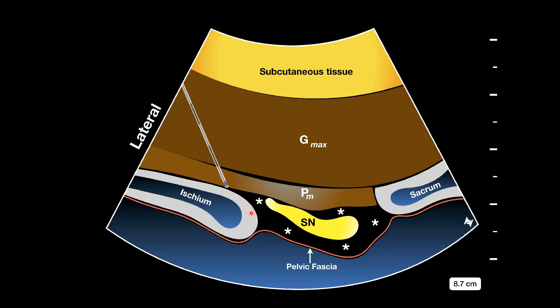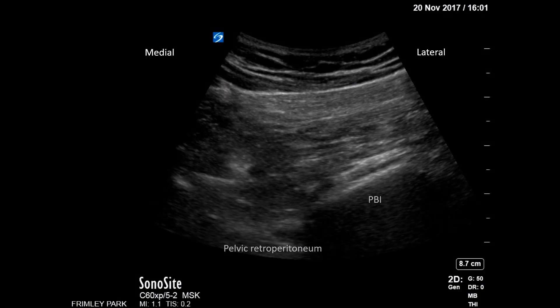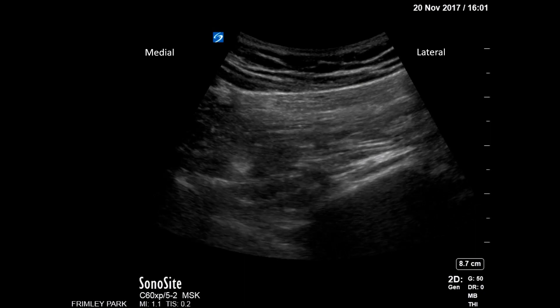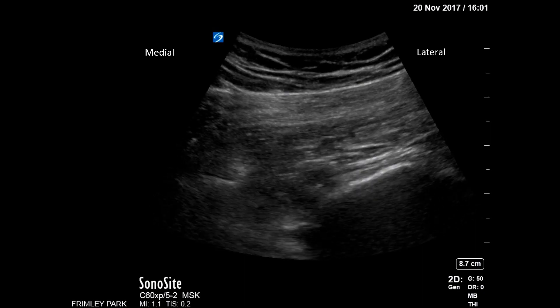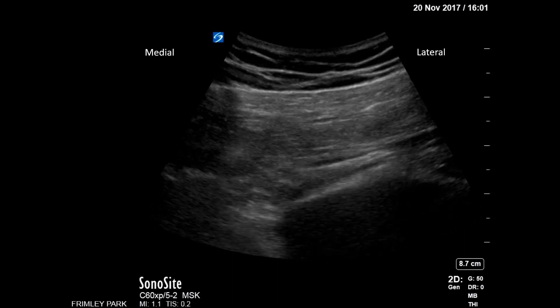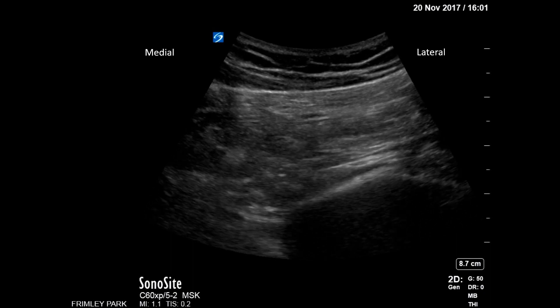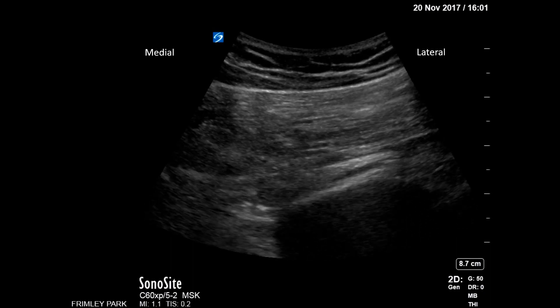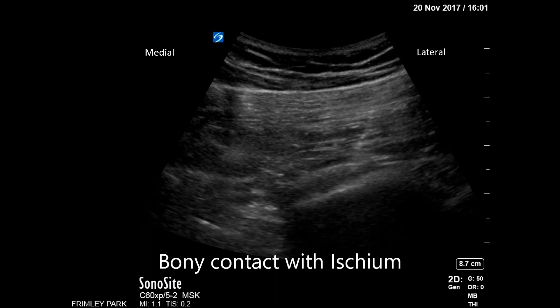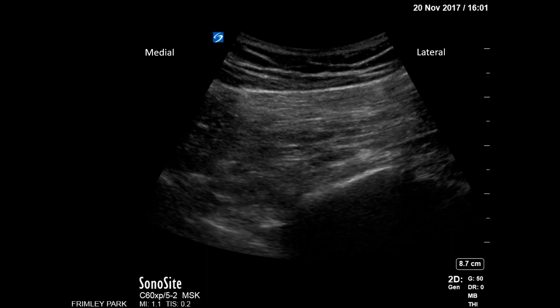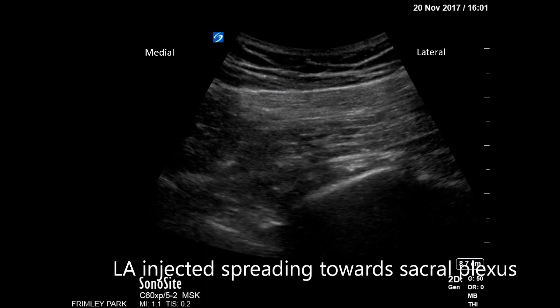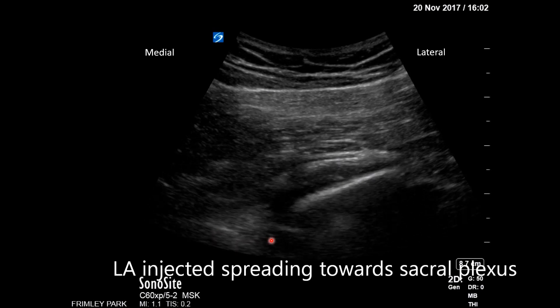A pictorial diagram depicts the posterior border of the ischium, the pelvic fascia, the sacral plexus, and the piriformis muscle, with the injection from lateral to medial spreading medially under the pelvic fascia. In the real-time block performance, the posterior border of the ischium is identified, the needle approaches from lateral to medial direction making only contact with the ischium, and the injection under the piriformis spreads medially to block the sacral plexus.